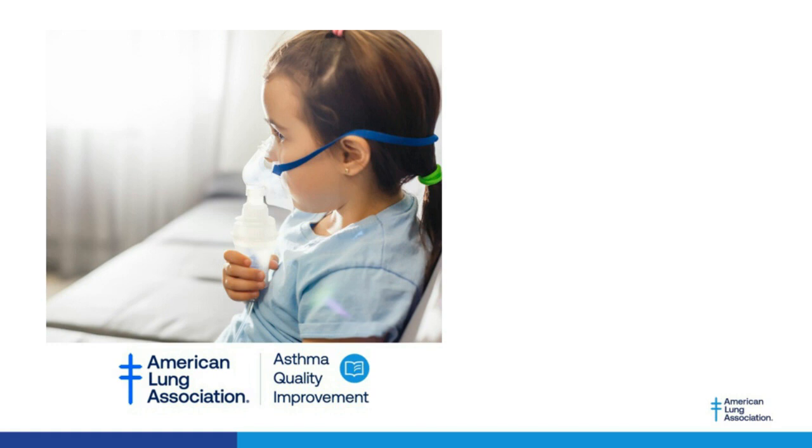Thank you, Ed. Dr. John Sweet is asking a two-part question. Would you consider the use of a peak flow meter and also exhaled nitric oxide in your exam room as an AGP? Dr. Sweet, my old friend. Well, of course you'd ask a really hard question. Just off the top of my head, I would imagine that a peak flow would possibly be an aerosol generating procedure. It's a forceful maneuver, and there's really no way to put an exit filter on there, because it would affect the results.